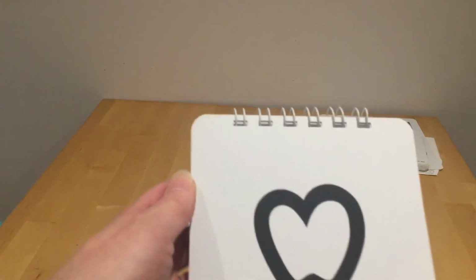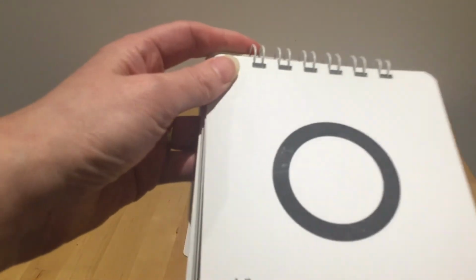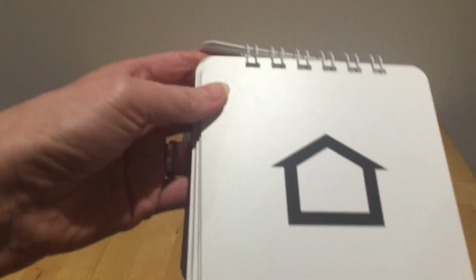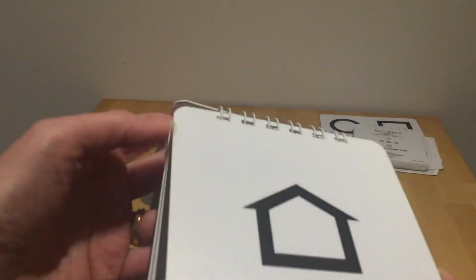So to do this test, we're going to either do one picture at each, because remember that the 4 symbols come in the same size. That's 3 over 30. Now it comes down to 3 over 24. So again, we might just choose one of those, skip the rest.